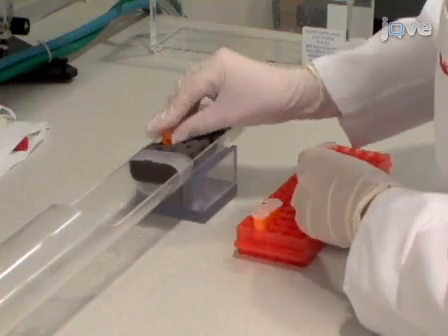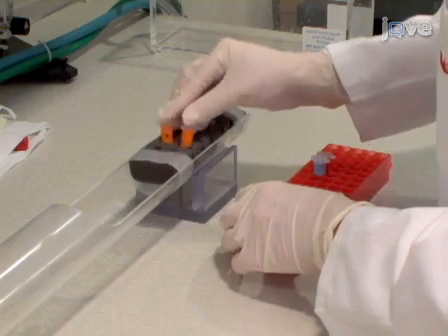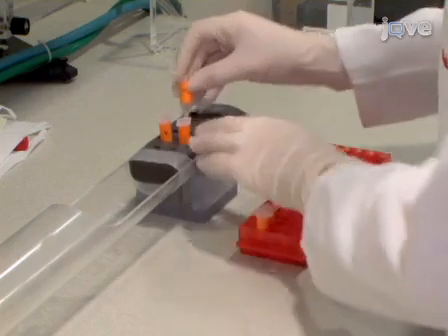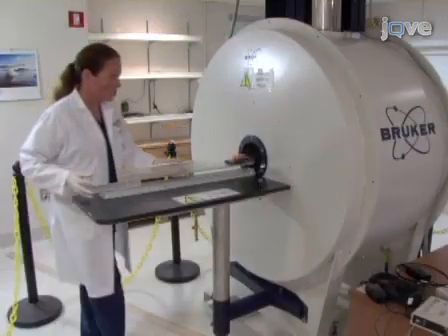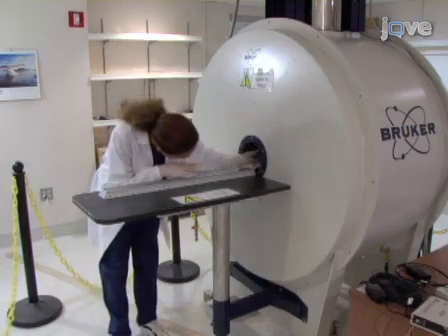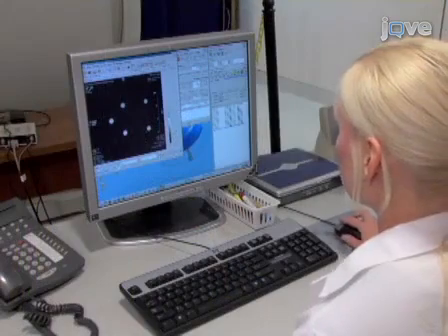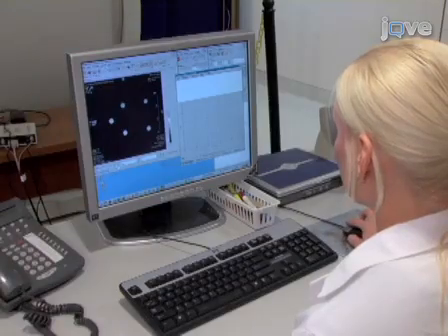Phantoms should be prepared in triplicate at a series of concentrations in order to quantify the relaxivity due to the SPIO uptake in cells. This provides an index of sensitivity and determines whether the nanoformulations may affect the oxidation state and hence the visibility of the SPIO in magnetic resonance imaging scans.